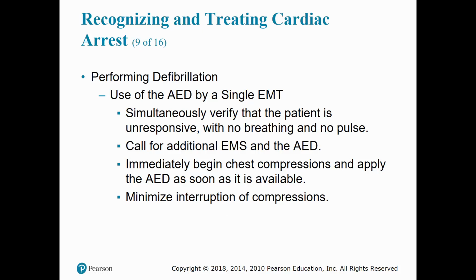Alright, use of the AED by a single EMT. Simultaneously verify that the patient is unresponsive with no breathing and no pulse. Call for additional EMS and the AED. Immediately begin chest compressions and apply the AED as soon as it is available. Minimize your interruptions in compressions.